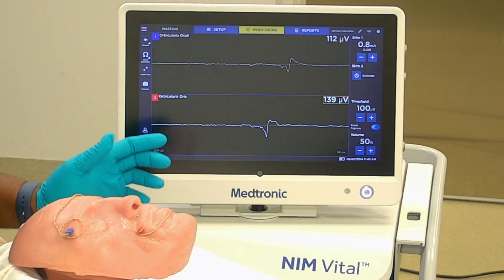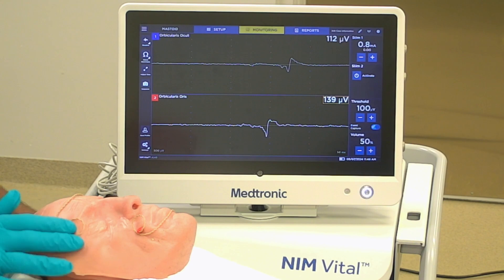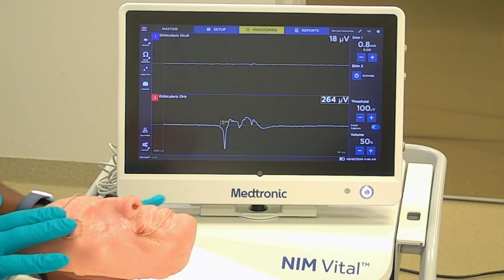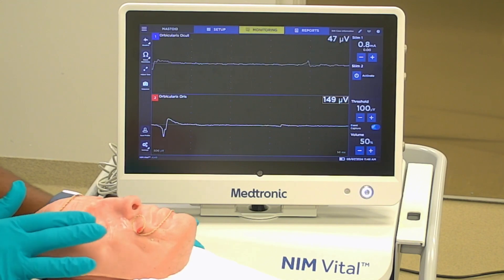Then you would go onto your monitoring screen and you would perform the tap test, which is just touching on or tapping firmly on each one of the electrodes, and you should be able to elicit a response on the channel. This is how you can confirm that your recording electrodes are picking up a response.